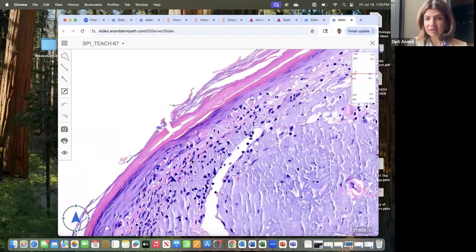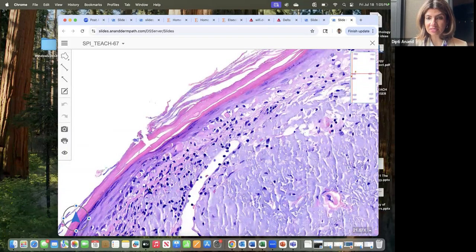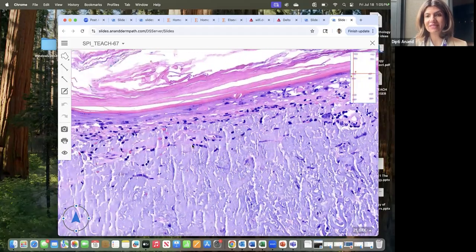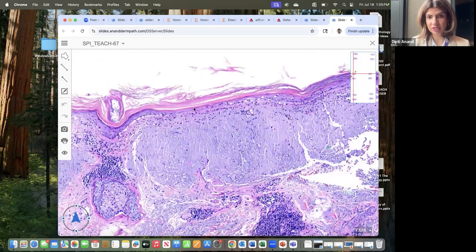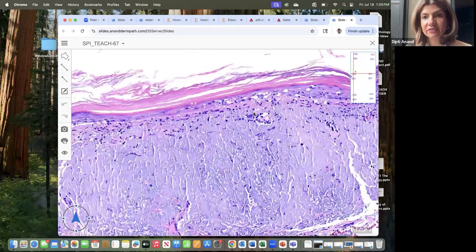And along with this, whenever you have chronic interface, because the DE junction has been insulted a lot, the basal epithelial cells start looking a little atypical because they have reactive atypia. That is what is referred to as squamatization of the basal layer. It looks almost like an actinic keratosis. Okay, so all these features of chronic interface dermatitis, wherein you get epidermal atrophy, hyperkeratosis, and a thick basement membrane, are classic for a connective tissue disease.